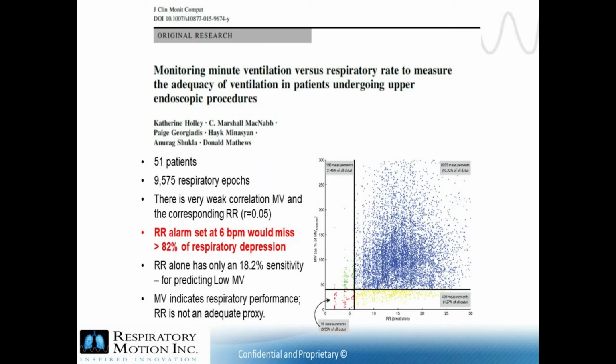After review of the American Society of Anesthesiologists closed claim database, it was revealed complications related to inadequate oxygenation and ventilation occurred 7 times more frequently in remote locations than in the operating room. The American Society of Anesthesiologists recommends that monitoring of ventilation be used in all anesthetic cases achieving moderate to deep sedation.